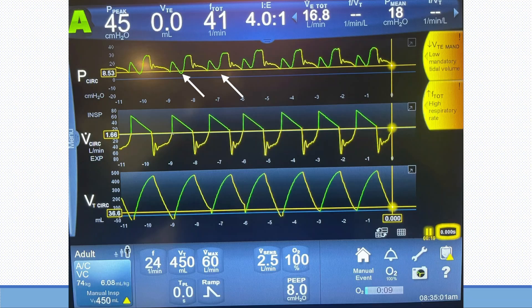As a result of this, you can see the flow is set at 60 liters per minute as a maximum and then decelerates exactly as per the settings. With this flow, we delivered 450 ml of tidal volume.